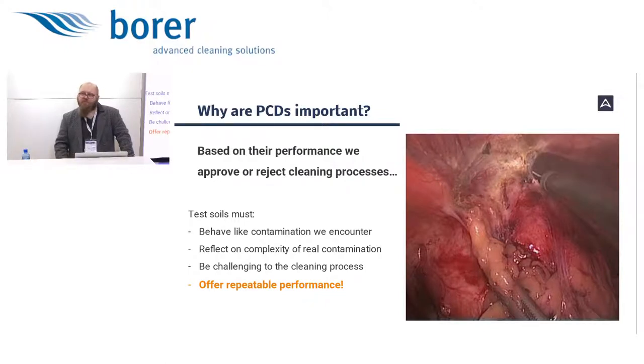I've seen other surgeries before, like robotic surgeries, where you just see small trickles of blood, lacerated wounds, and not much content. But this time, it was absolutely horrific to understand how much blood is there. And then you imagine that the piece of tissue that the biopsy is taking is then traveling through your biopsy channels, leaving traces of the blood that was there, plus bits of the tissue that was removed, on the inside of that channel. So after I saw that, I was just praying that the man or woman who had that instrument in them before me were all okay. Right? Because again, we here really know what that can mean.